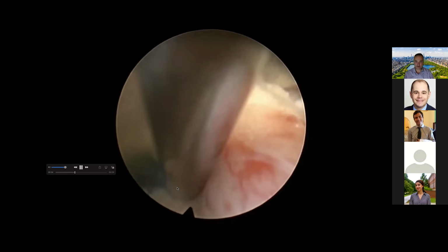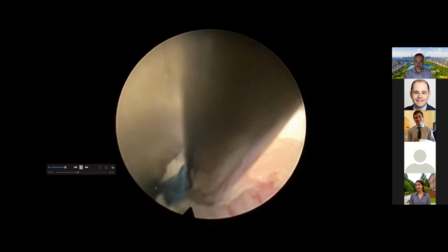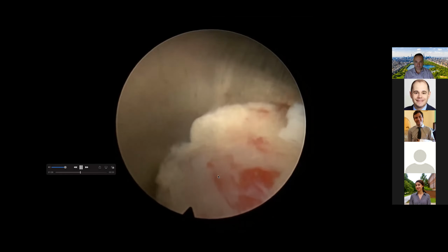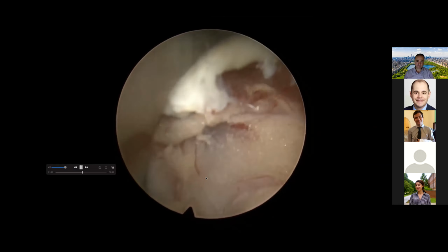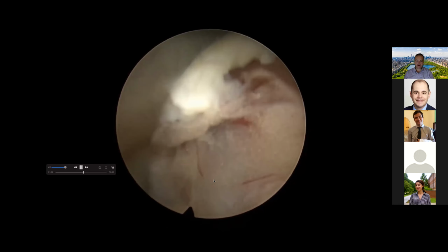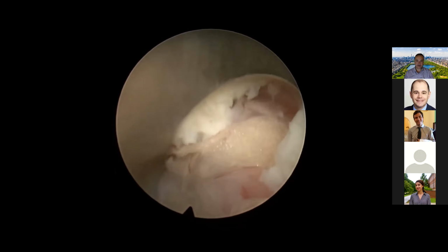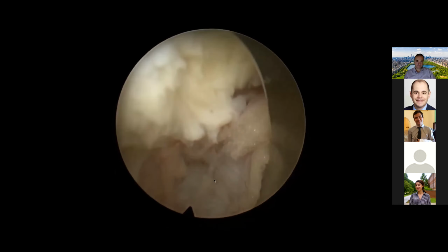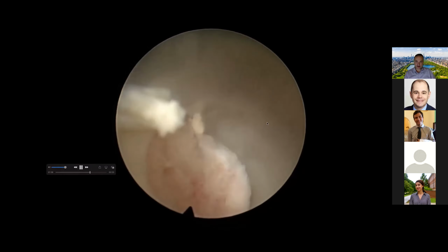Again, we're dissecting here a little bit more. You see here's the deep end of the cannula, and here are the neural structures that we need to protect. And at about this point, we start to rotate very carefully. You see here now we rotated that, and we have retracted the neural structures medially, and we are protecting them.